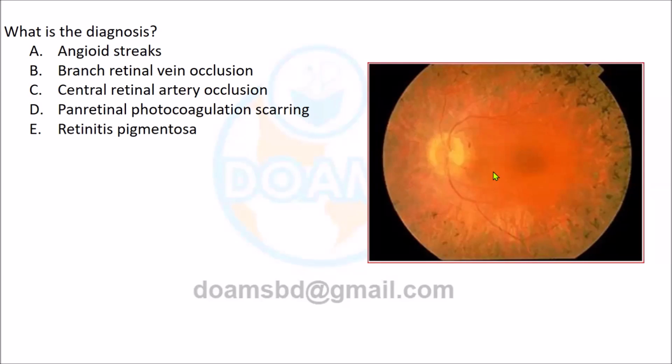Laser therapy spots would be radially arranged from center to periphery, in a row, in a line, spot to spot. But here you are looking at blackness in the periphery, not in the center, not involving the macula. And what is the appearance of the vessels, Dr. Mohsin? Vessels are very much less, even from the very center. So they are attenuated vessels.